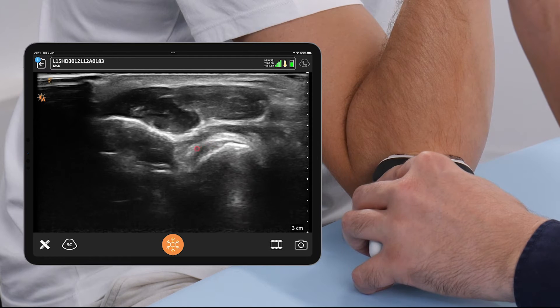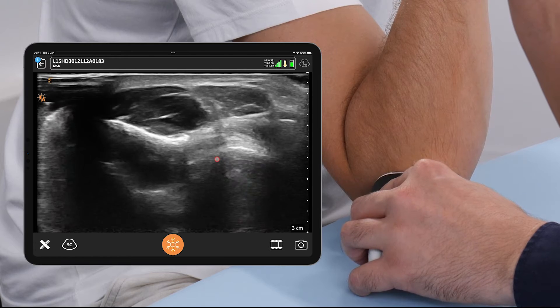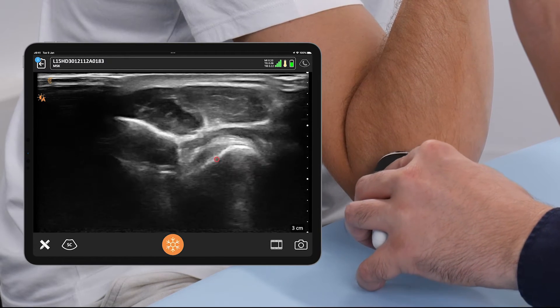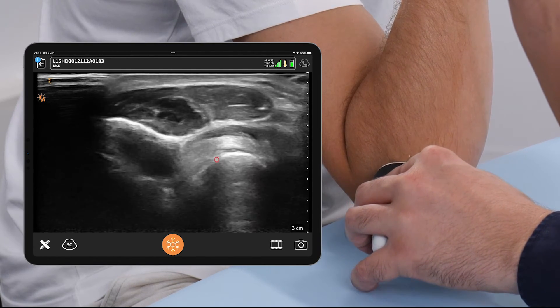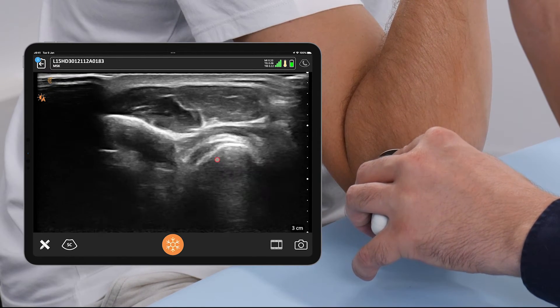We're going to scan this distal biceps tendon a little bit more toward the table and then in the other direction so that we can see the full fibers of the distal biceps tendon insertion.